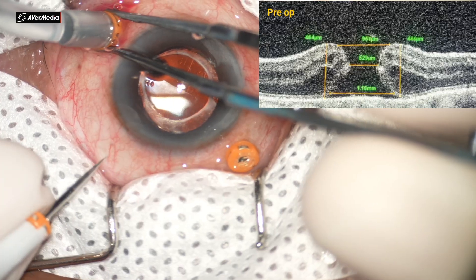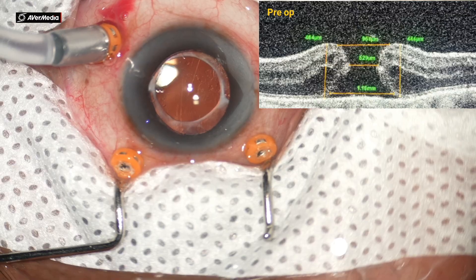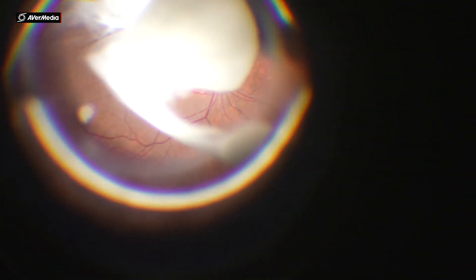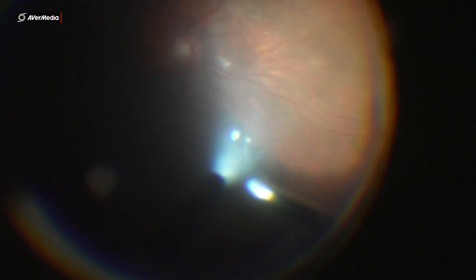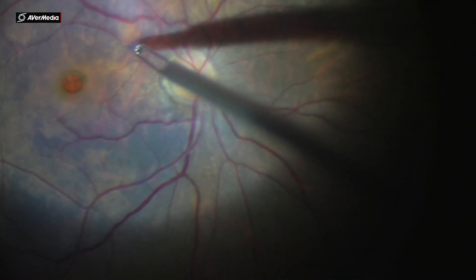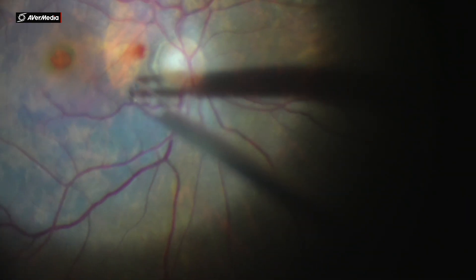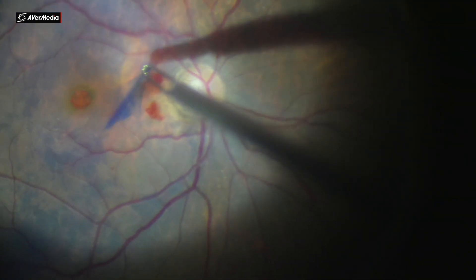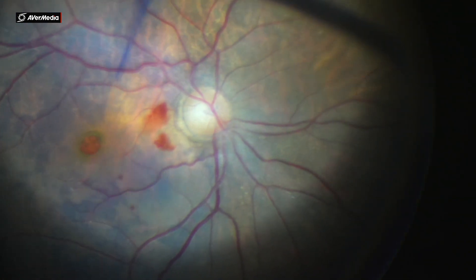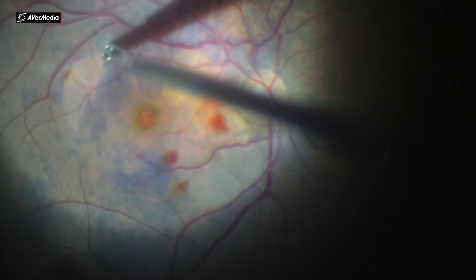In our second case, we have a 60-year-old female with a macular hole measuring more than 400 microns, with best corrected visual acuity of 6/60 on Snellen's chart. 23-gauge ports were made and triamcinolone-assisted vitrectomy was performed. The ILM was stained with brilliant blue and the nasal ILM was peeled.